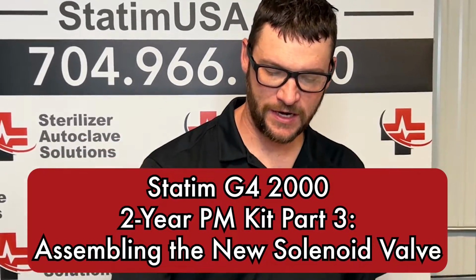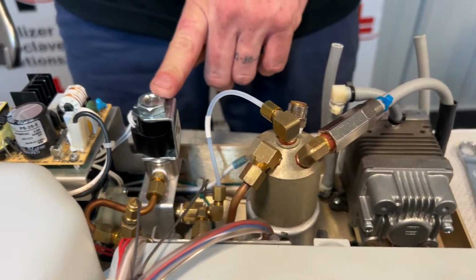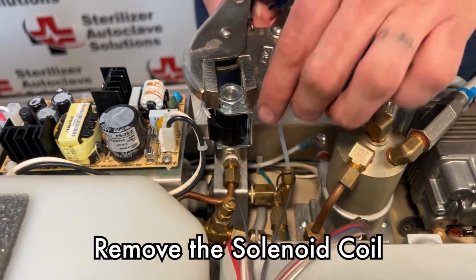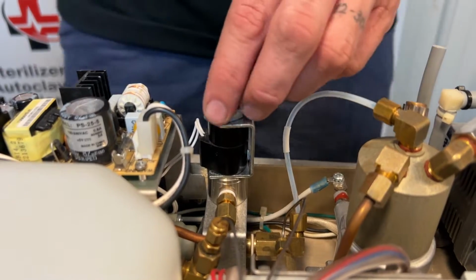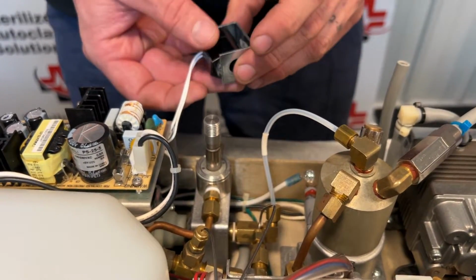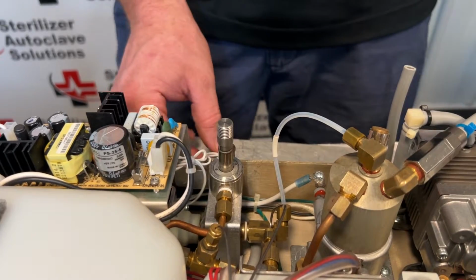Today we are going to be doing the 2-year PM kit on a Statim G4 2000. To check the solenoid and or clean it, it is right back here. I'm going to use pliers and pull that nut off. Once that's clear, you can lift up and it should come off. You have your metal C-clamp as well as your solenoid coil.